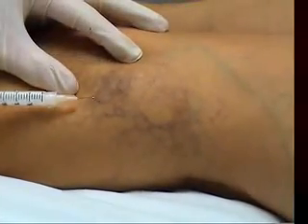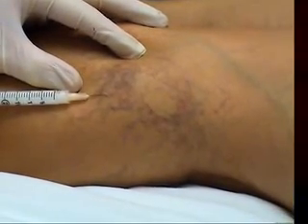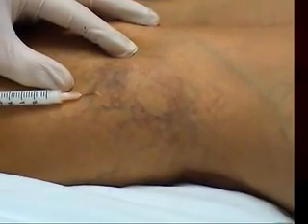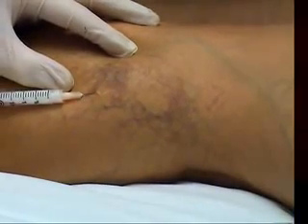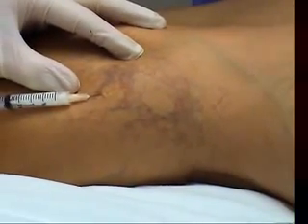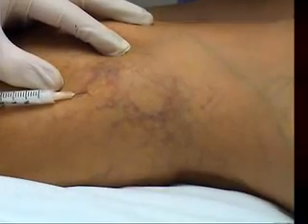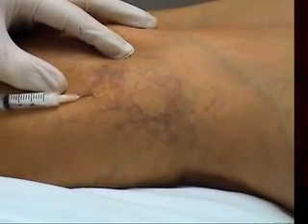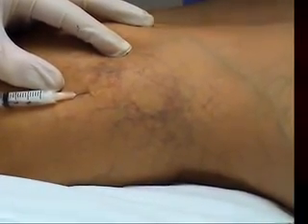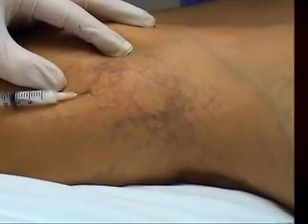Okay, this is a good sized vascular complex. Just going to bend the needle up a little bit. We're using foam, 0.1%, in that vessel there, and then you'll see it gradually filling. You have to put a fair amount of pressure on this. It's different to the regular 0.1% sotradecol. But don't put too much force, otherwise you'll extravasate. You can see it gradually filling up here, and then once it fills up, it'll take some time for the blood to come back again.